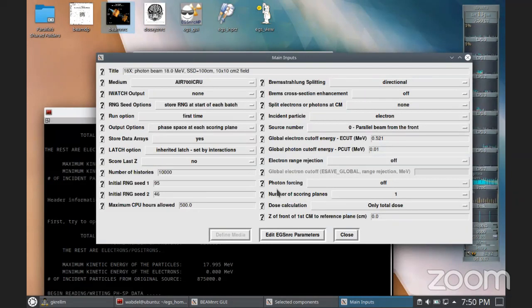What you can do, this is the trick about it. That's why some people record the dose in the monitoring chamber, because the MU is defined as centigray per dose monitoring chamber. So when they do the simulation, they record the dose in the monitoring chamber, and they take that as something that represents a monitor unit. But don't think, with a beam, that I'm going to give more particles to get a higher dose. No, because everything is normalized per particle.